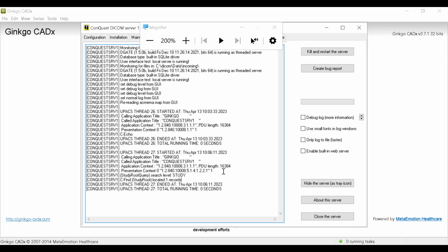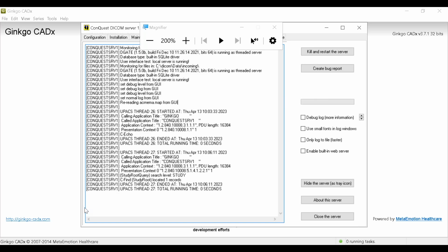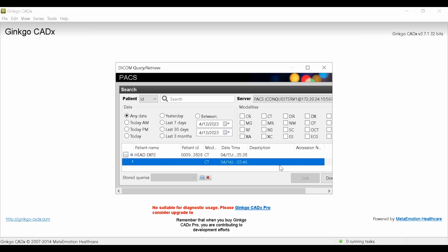Let me zoom back out of this. Where do we zoom back out? Shoot, I lost my zoom. There it is. We're going to zoom back out. I'm going to minimize that just in case I need that again. We're going to go back over here to the Ginkgo CAD. We're going to see that this is here. I have to actually download it. I can expound upon this and it'll show me the images.